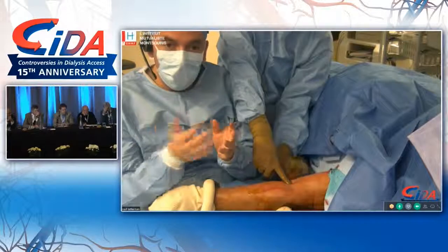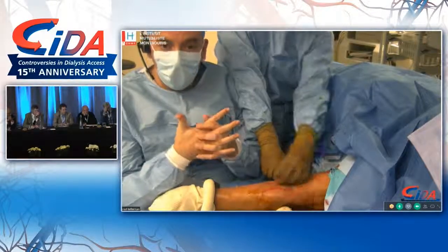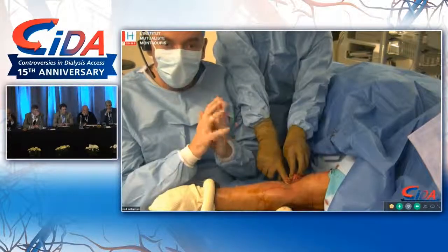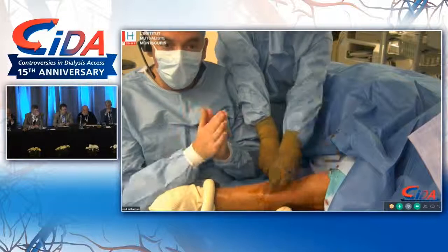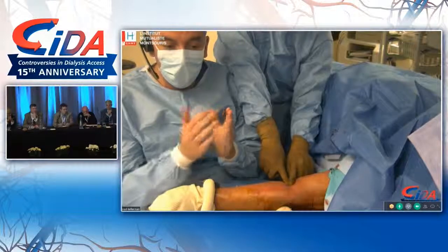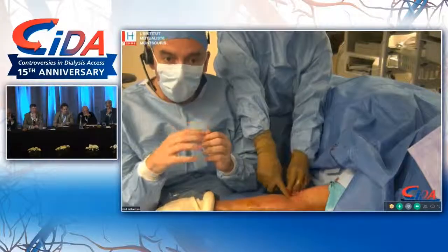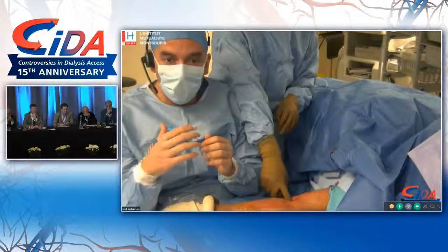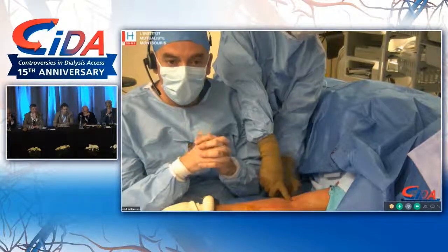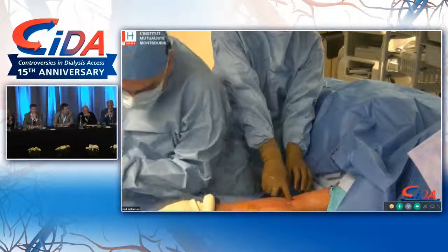In some patients, now we have done 156, after a period of time you may need to ligate a basilic or a brachial vein, especially if the dialysis center is far away. We get patients coming from Guyana or other places, and if you're not able to coach them and teach them how to stick the fistula, you want to make it more straightforward, like a higher pressure surgical fistula, so you may need to do some things like that. But it's not the rule. It's rather the exception.